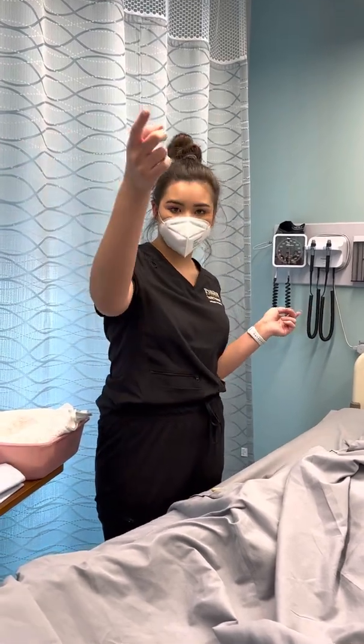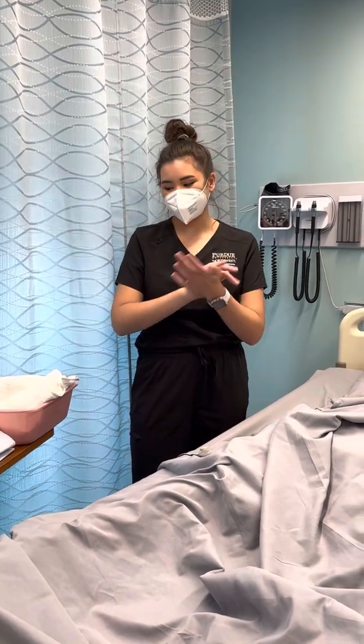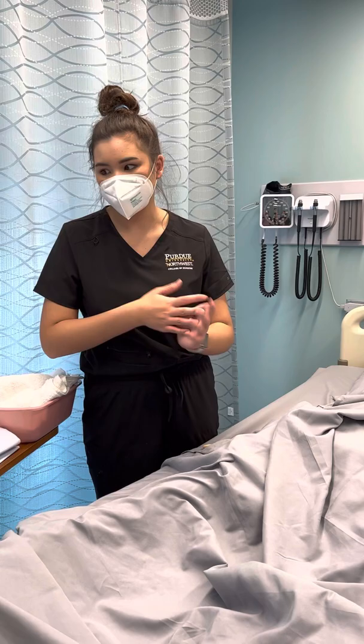Then I'm going to identify myself and close the curtain and say: Hi, I'm Isabella, I'm your student nurse today. I'm going to wash my hands, or clean my hands, and then put my gloves on. And then I'm going to identify the patient by their name, date of birth, and then their wristband.